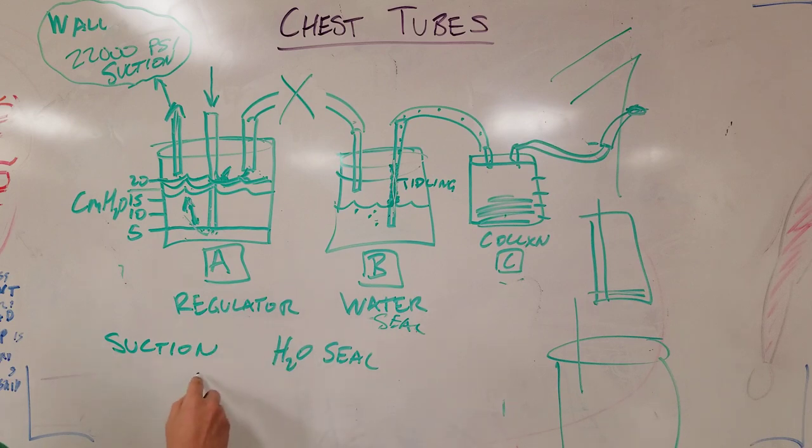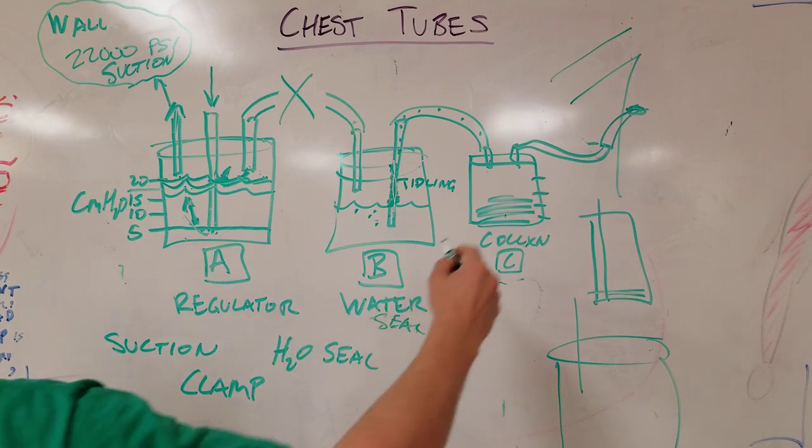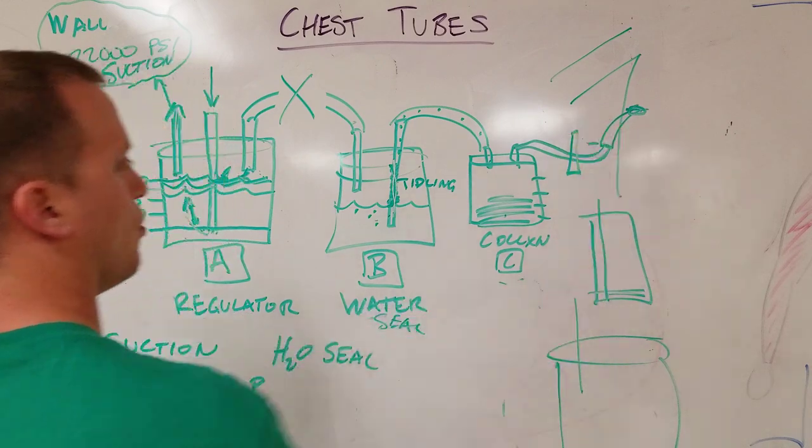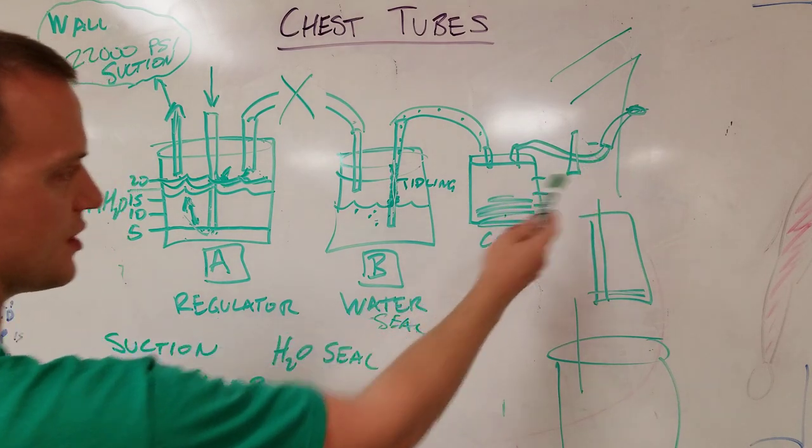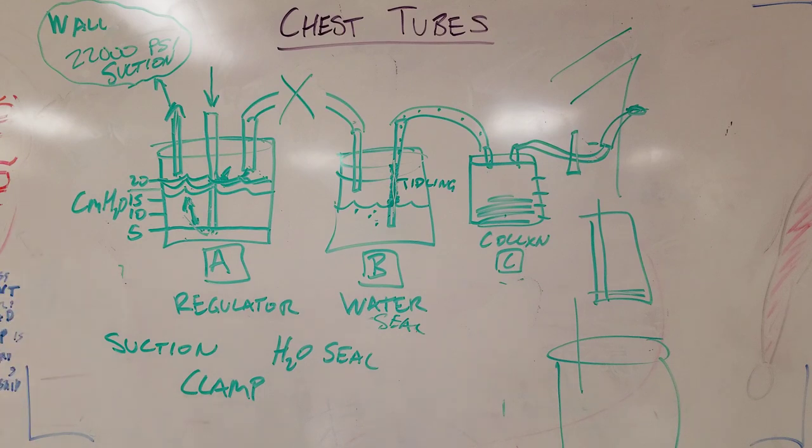It can be clamped. And a clamped chest tube is kind of rare, and usually thoracic surgeons or general surgeons will do this. We'll come over here to the actual chest tube itself and we'll clamp it. We would clamp a chest tube to simulate what it would be like to have no chest tube, right? Because if this is just a piece of plastic sitting on this chest and it's clamped and it's not in communication, it's not patent with anything else, it's simulated as if the chest tube was out. You might do this if you wanted to know, hey, I want to pull that dude's chest tube in 6 hours, but is he going to fly and not reaccumulate a pneumothorax if I pull it? So we would clamp the chest tube. These are really your three options.